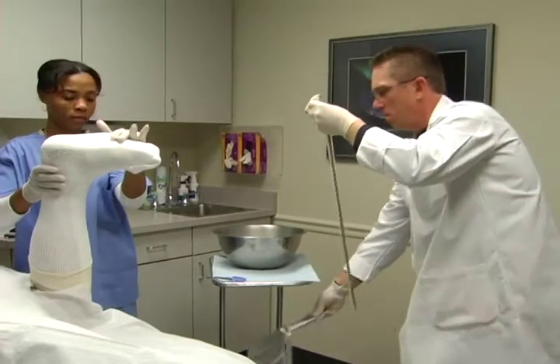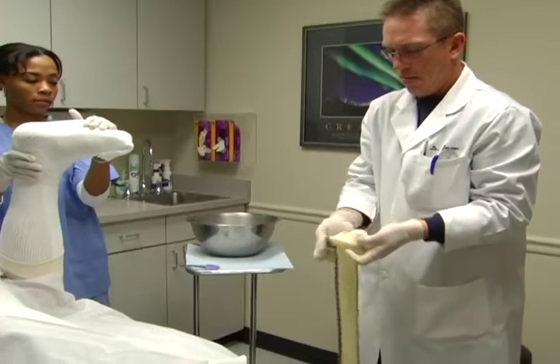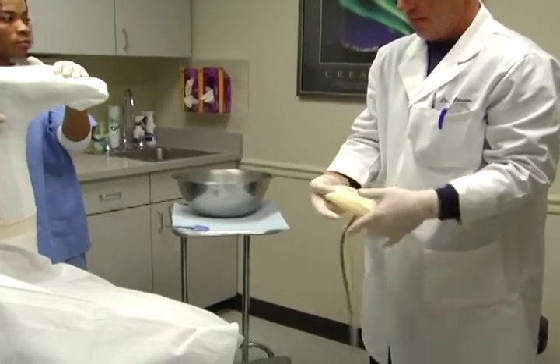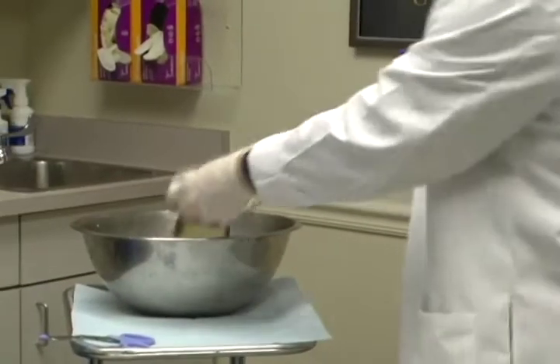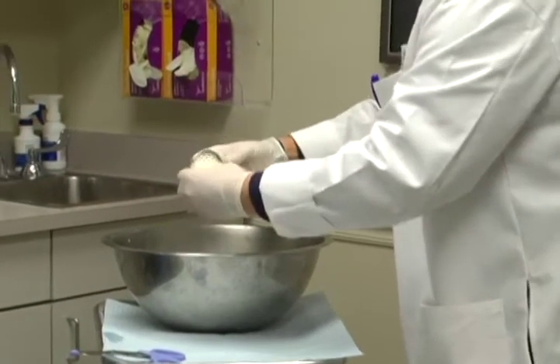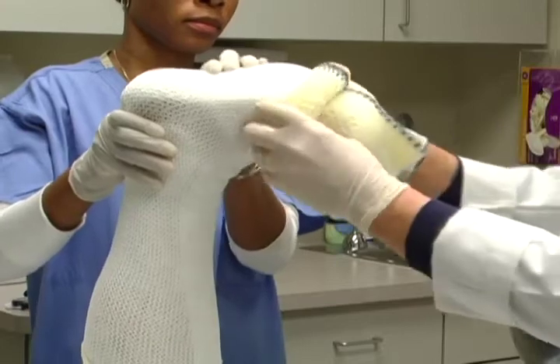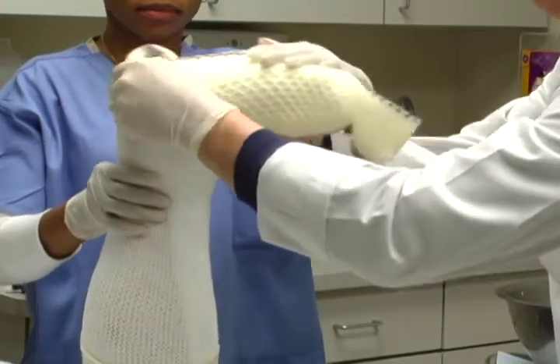Step 7. Cast sock. Remove the cast sock from the bag. Roll the cast sock into a donut shape, leaving about 2 to 3 inches of unrolled sock. To ensure thorough saturation, immerse the rolled sock in room temperature tap water for about 5 seconds and gently shake out any excess water. Use one gentle stretch and apply the cast sock by positioning it on the foot so the unrolled end extends beyond the toes by about 1 to 2 inches. The placement of the colored stripes is not important.